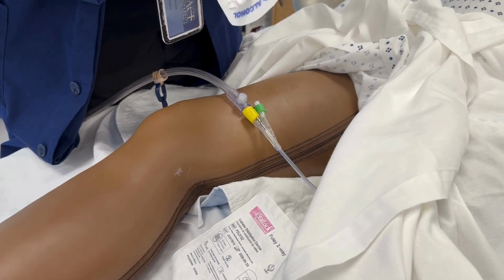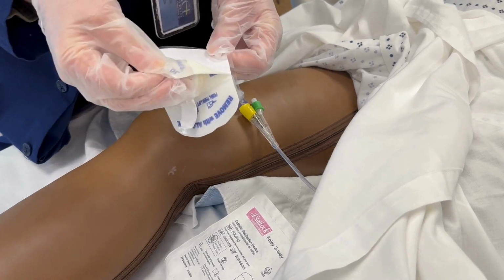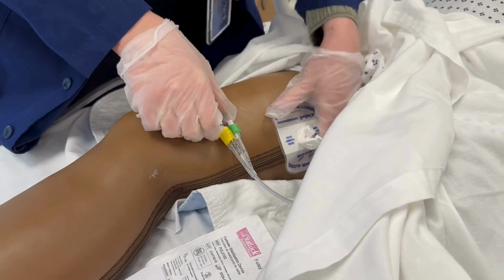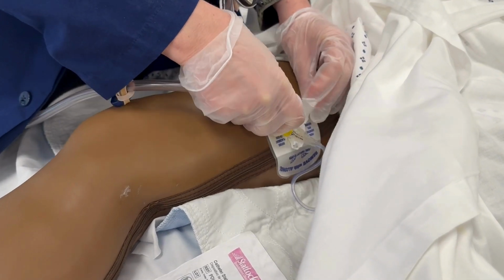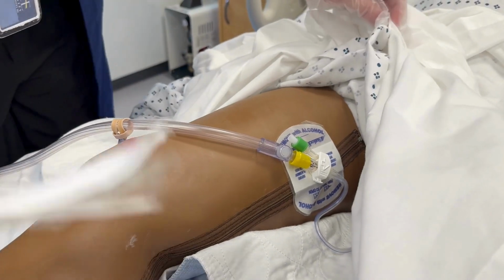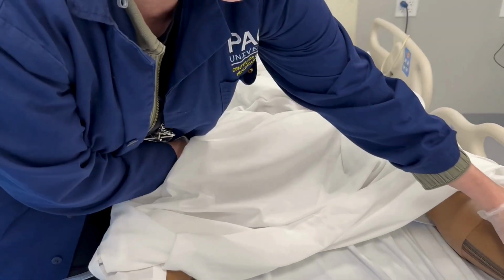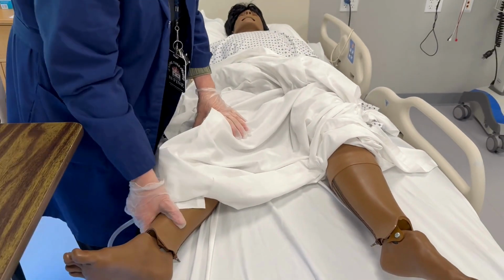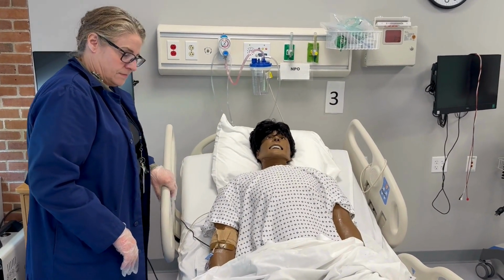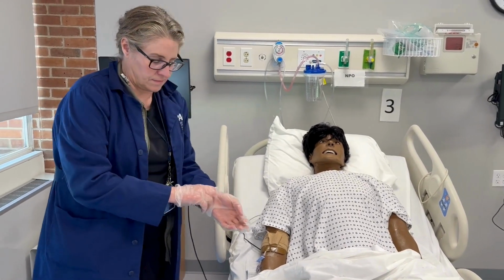Ensure there is no tension on the tubing. Assist the patient into a comfortable position. Remove gloves and perform hand hygiene.